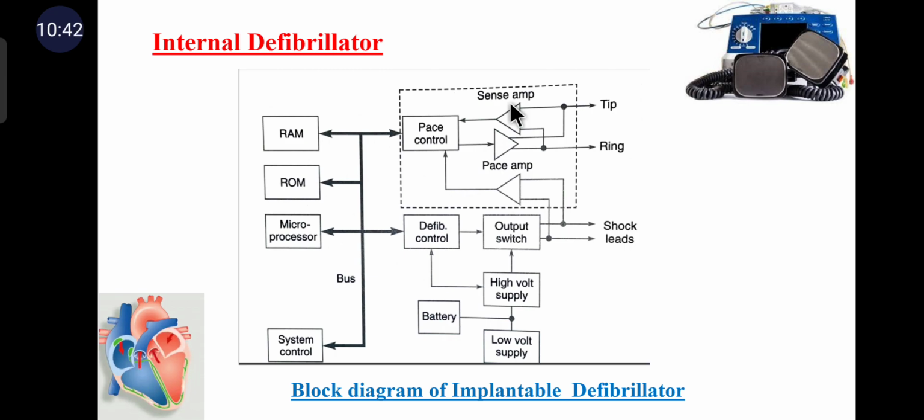From the electrical standpoint, the sense amplifier must be able to operate properly over a range from 30 to in excess of 360 bpm. The heart signals of interest lie in the range of 100 microvolts to 20 millivolts, and as a result must be amplified prior to being processed.